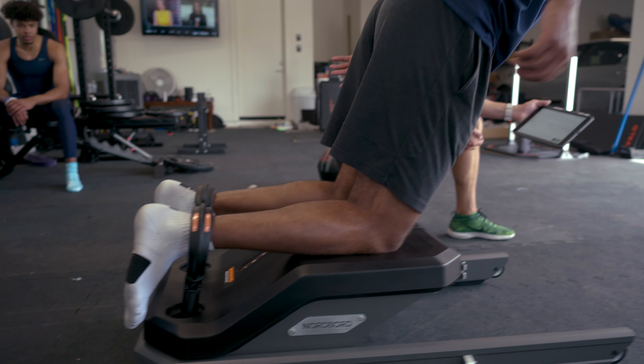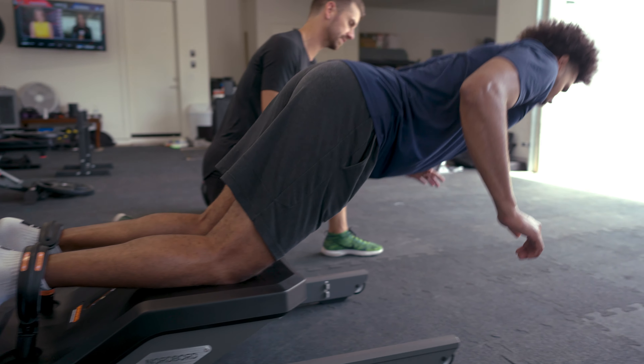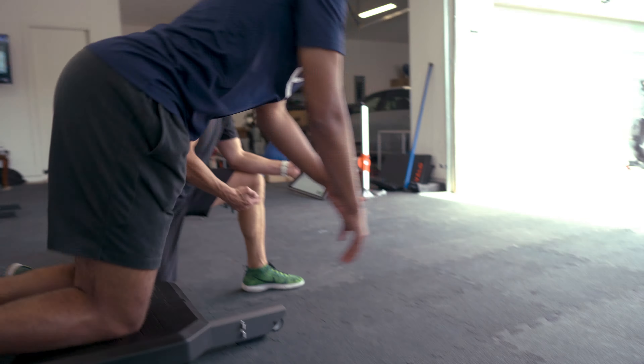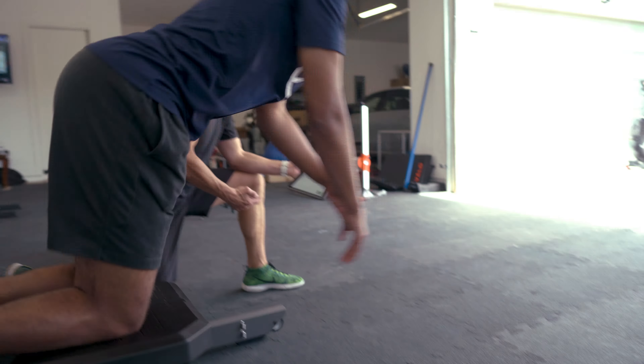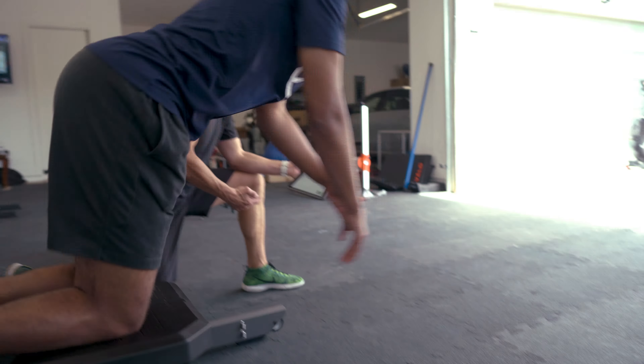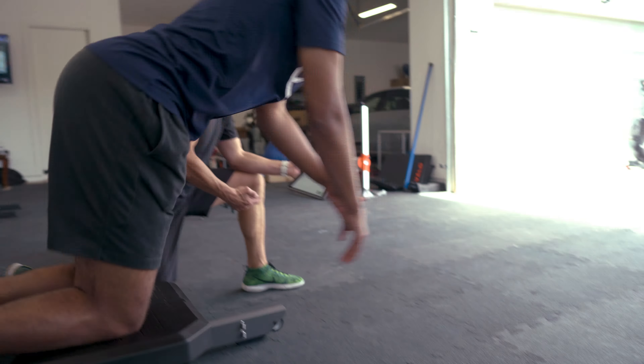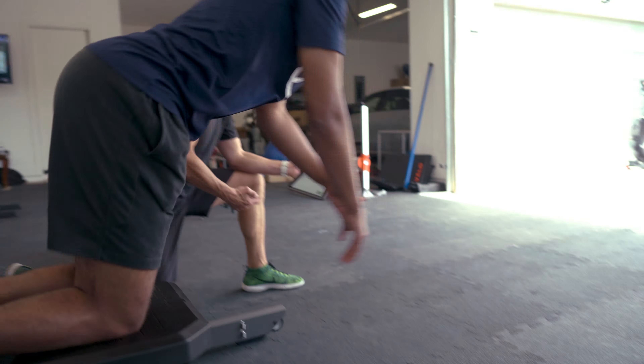Here's why we use the NordBoard in a non-rehab case. The first thing is we want to assess the normal level of asymmetry. We all have a normal amount of asymmetry — we just want to keep that number underneath 10 to 12%.